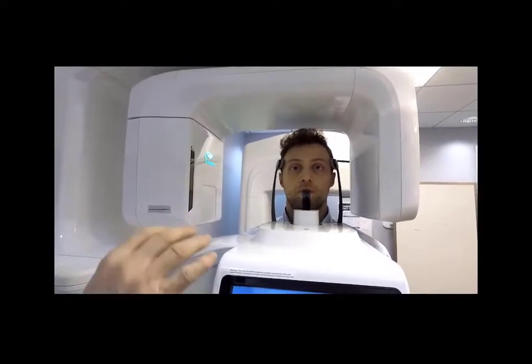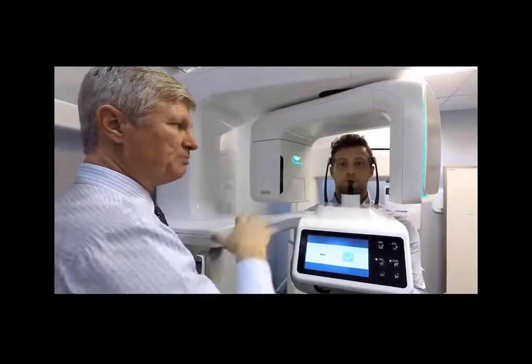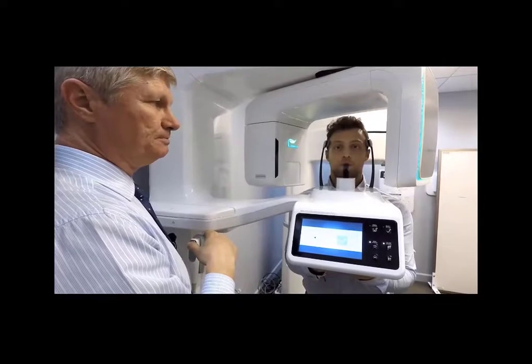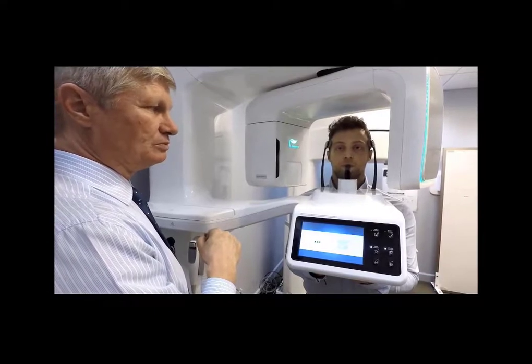And please wait. As a side note, it's probably a good idea to stand here with the patient during this process, because we can then explain to the patient that it's just simply rotating around to get into capture mode. The system is ready to capture an image. Please close your eyes until image capturing is complete.